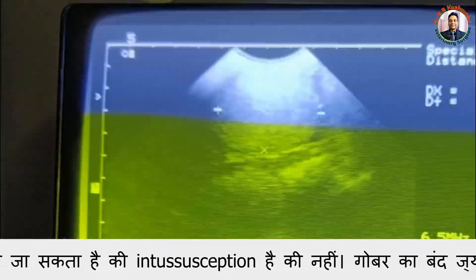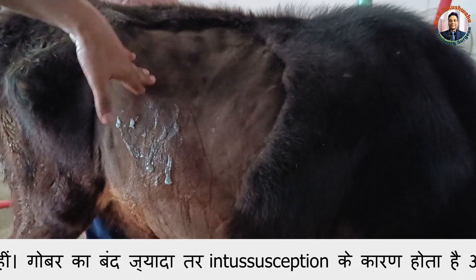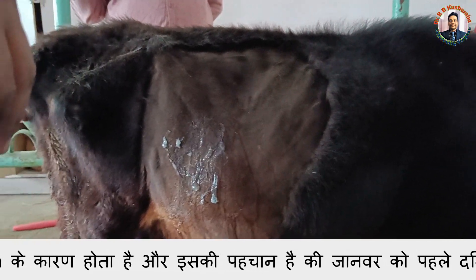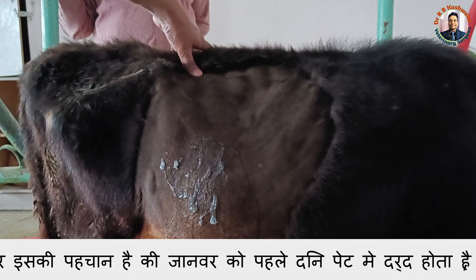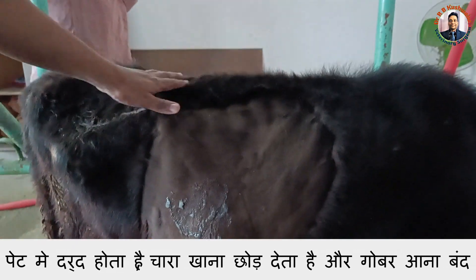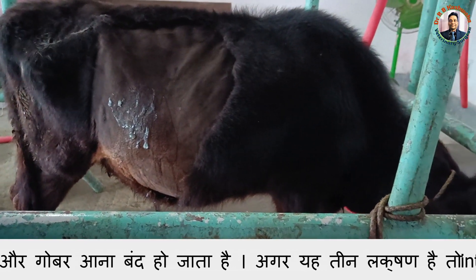The diameter of the intestine measures 3.5 to 4.3 cm. By ultrasonography, it is confirmed that this calf is suffering from intussusception. Other history such as absence of feces, the key sign, and the animal being anorectic all match with intussusception, and ultrasonography is also suggestive. So this is a confirmed case of intussusception.